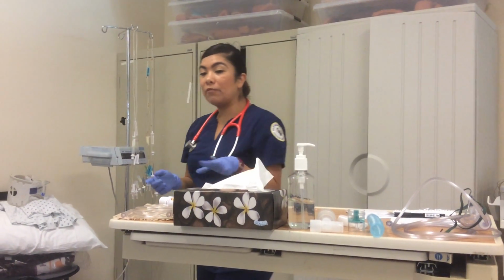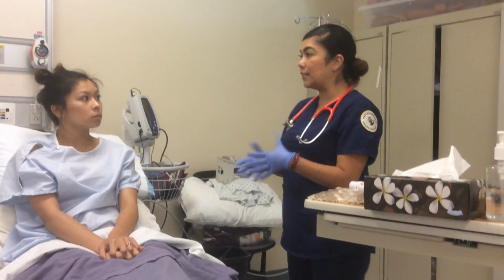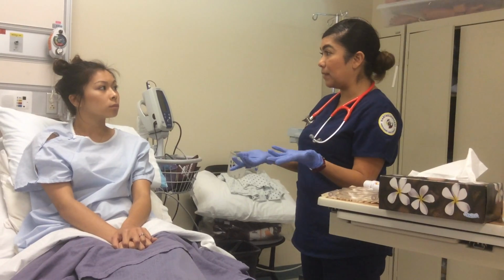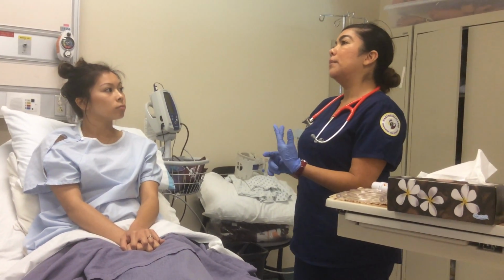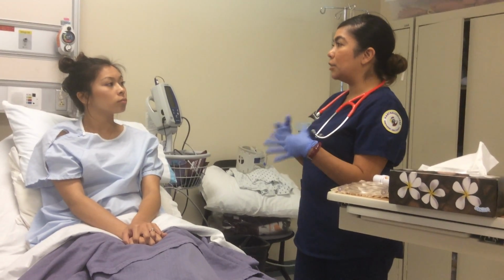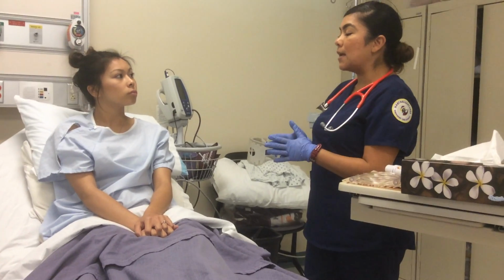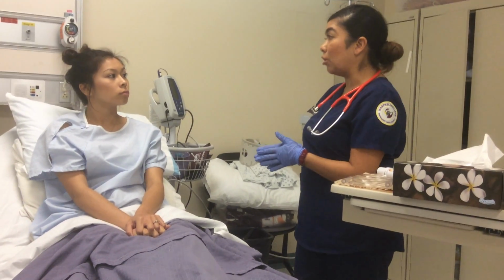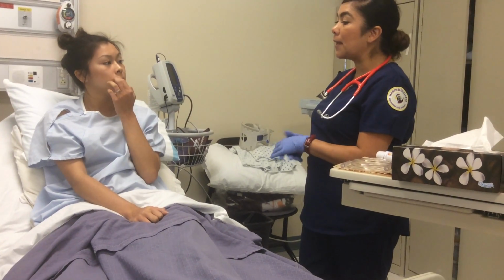Okay, now before I start with the medication, I do want to let you know some side effects that could be expected with this medication. The medication could probably make you a little bit jittery, make your heart rate increase, and that's completely normal, okay? I don't want you to feel as though you're having anxiety or anything like that, okay?